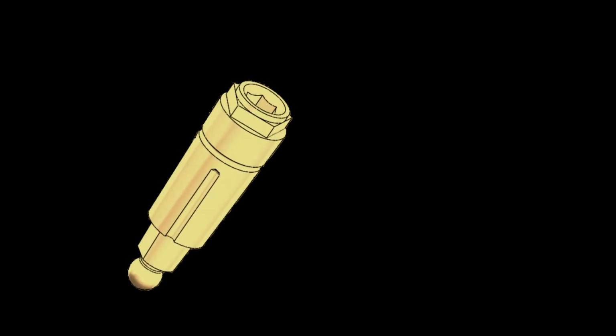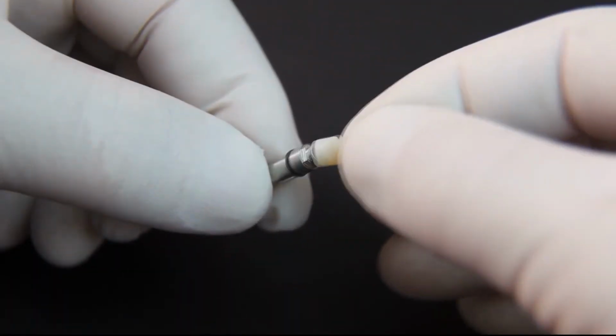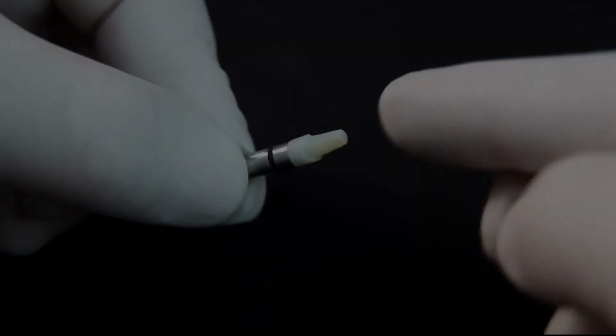Besides, the analog has an outer circular platform with an external pentagon. The pentagon, together with the existing inner hexagon, which serves as an anti-rotation connective element, provides stable fixation and stability of the future abutment duplicate using one of the methods of abutment duplication. But the main purpose of the external pentagon combined with the inner hexagon is to provide the only correct positioning of the abutment duplicate on the analog in case of its unforeseen detachment.